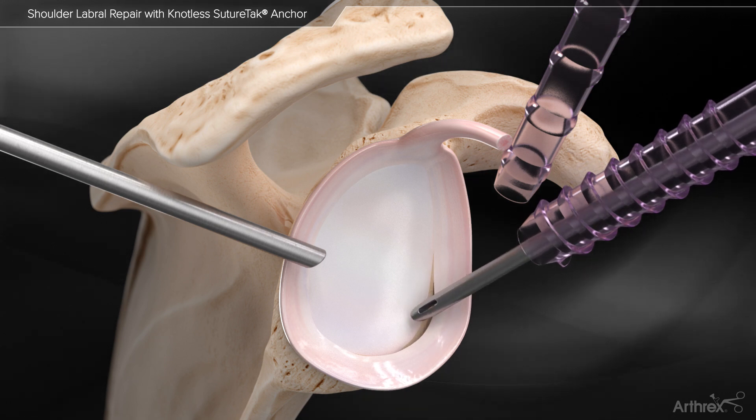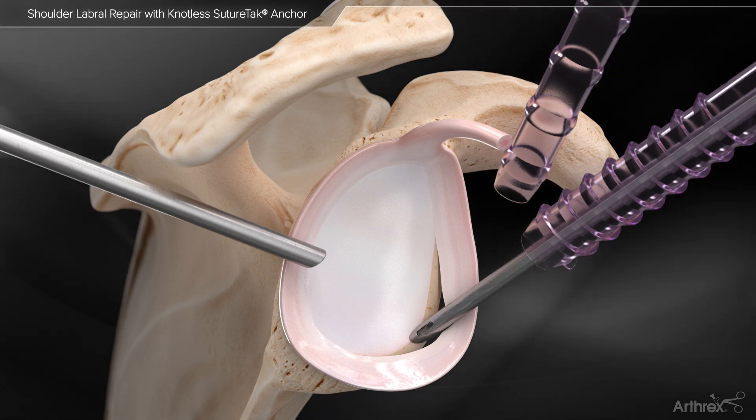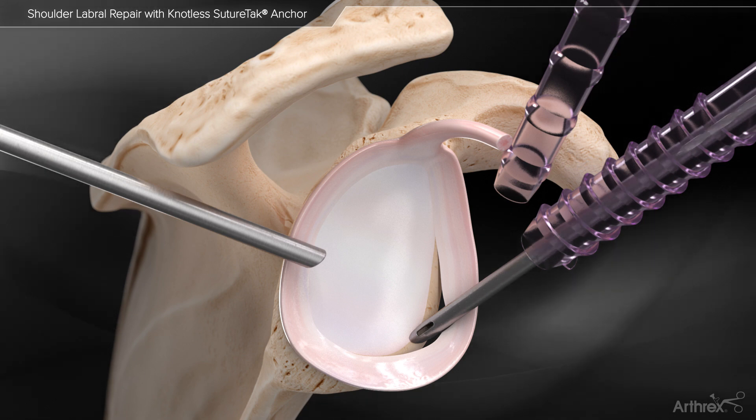The spear is inserted and placed on the glenoid rim to drill the bone socket. Leaving the spear in place, the knotless suture tack is inserted through the spear and impacted into the bone.